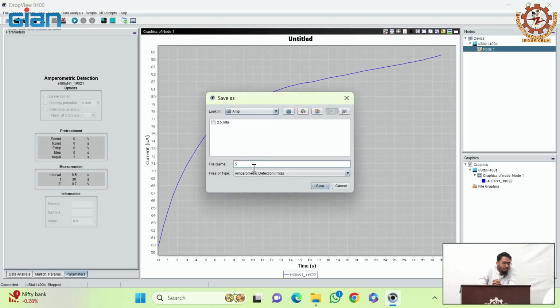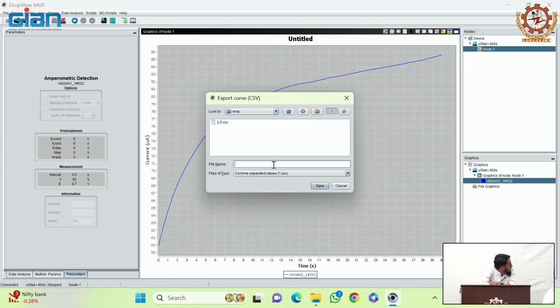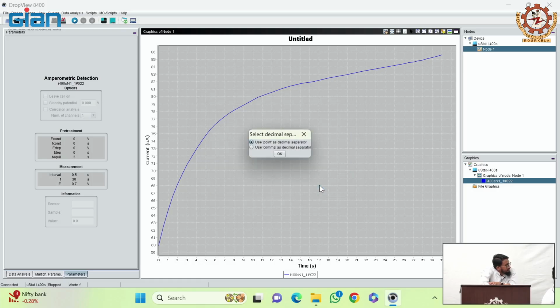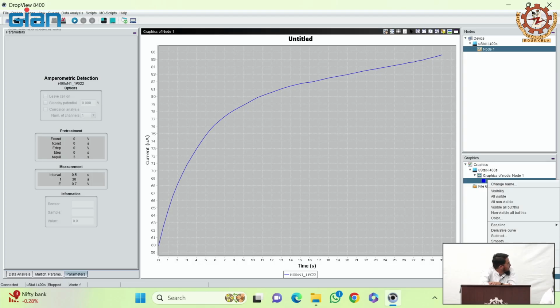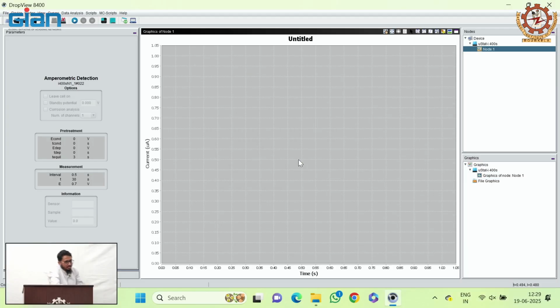Done? Current value. Rishita, what is the current value? 86. Okay. You can choose a current value when the curve is more or less stable, not at the start. You can keep it running for longer as well. You can run it for 1 minute, 2 minutes, and wait for the curve to stabilize.